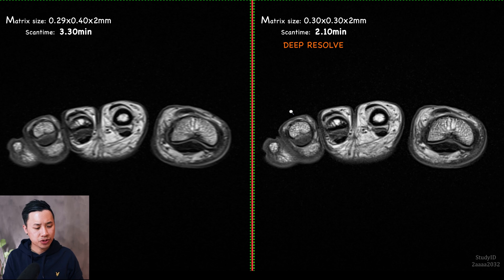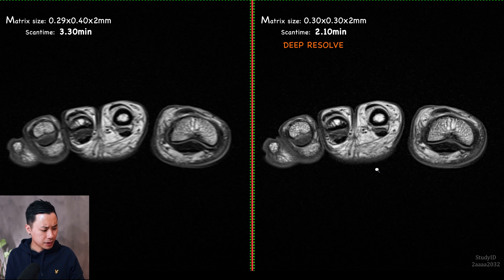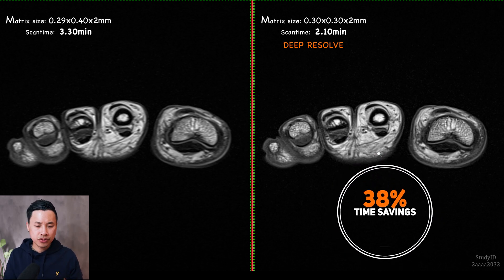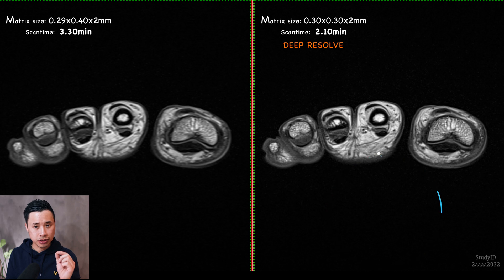The last images I want to show are the forefoot. This is a T1. You can see on the left side there is no DeepResult, and the other one has a lower resolution with DeepResult applied. The scan time here is around 3 minutes 30 versus 2 minutes 10, so we save around 38% of scan time. The way I used DeepResult in this test was to see if I could save scan time while still having sharp, good images.